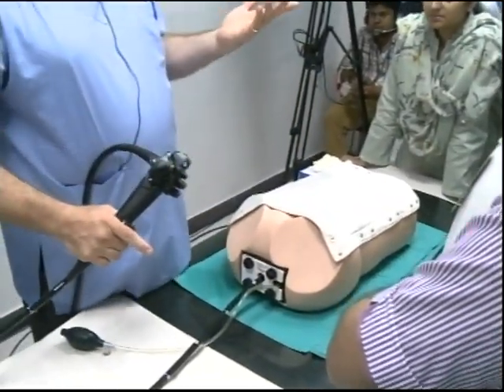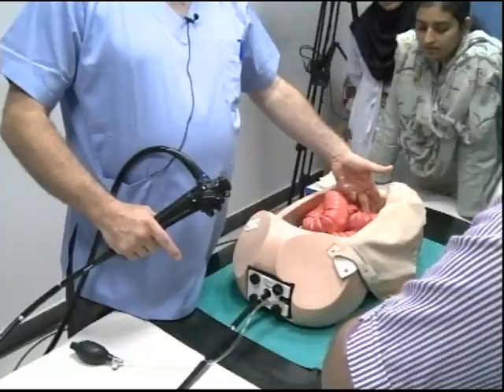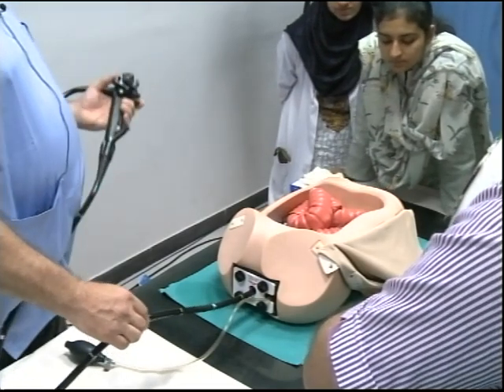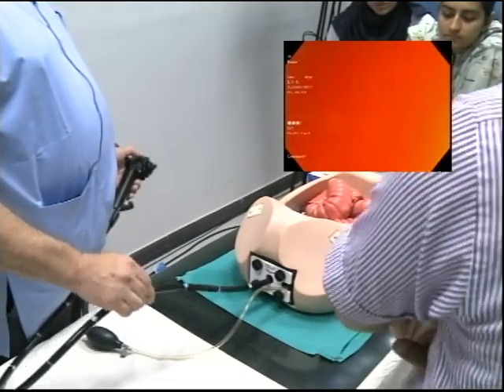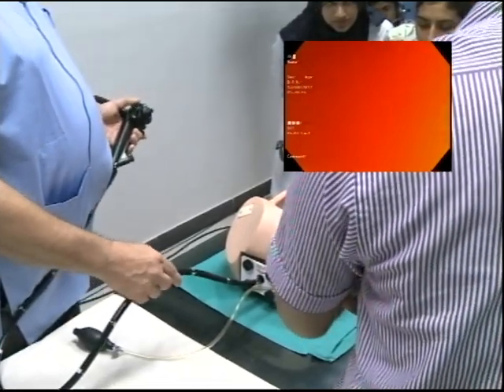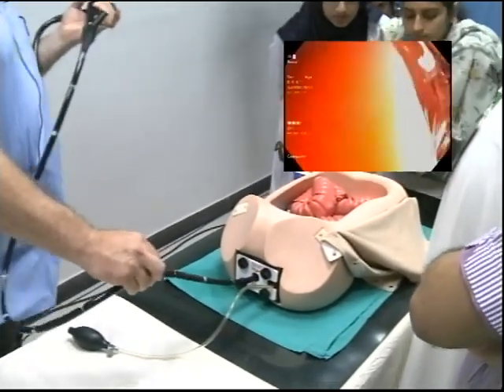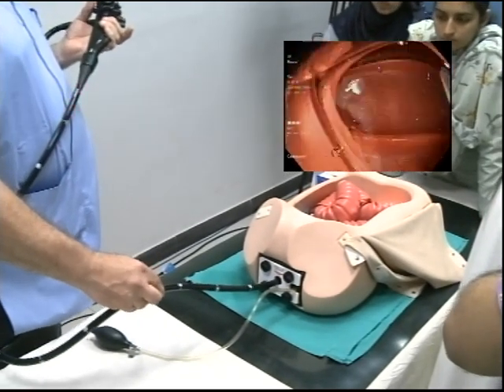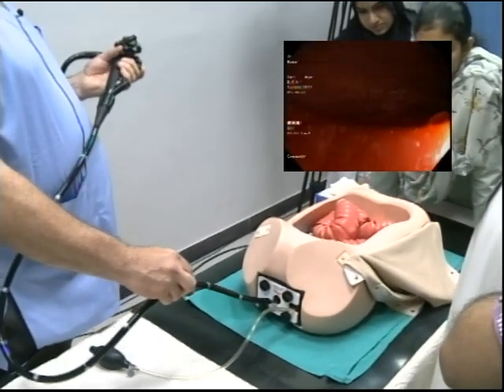Right, patient's on the back. So the first point we've come to where the scope is sticking. See where we are on the splenic? If we actually do an anti-clockwise torque, the scope will actually go posterior, the tip. Anti-clockwise torque will do what to the tip of the scope? See it? Can you do it again? Because of how the scope is looking on there, where would we want to go? We want to go clockwise, don't we? On there. Because it's clockwise. If we go clockwise, when the scope goes forward, it will actually take the scope posteriorly.